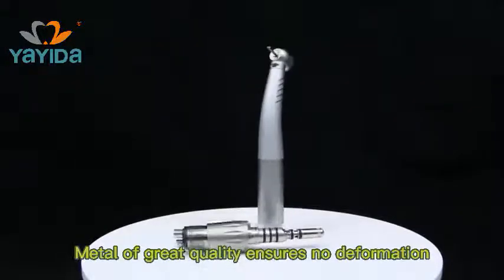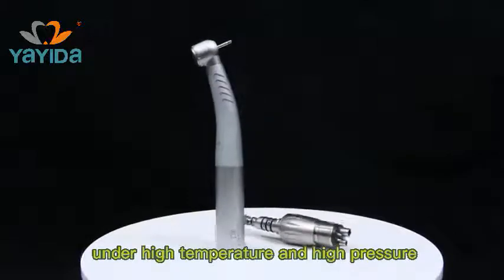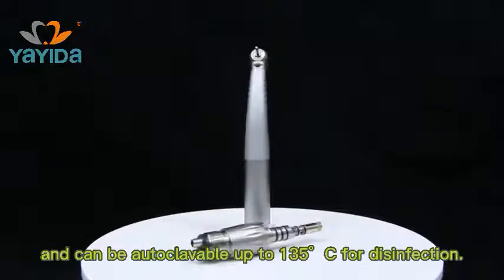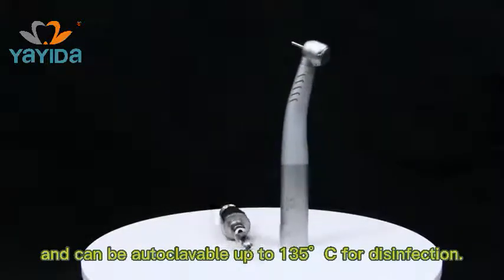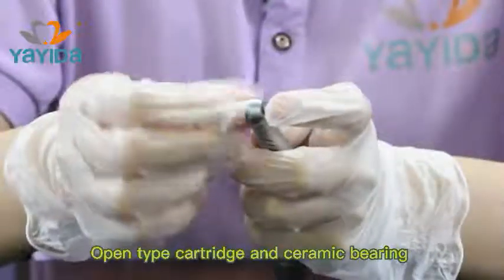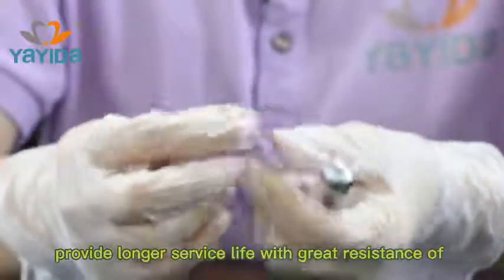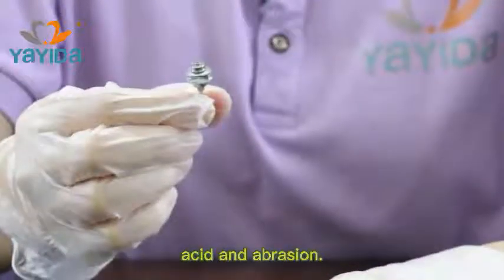Metal of great quality ensures no deformation under high temperature and high pressures, and can be autoclaveable up to 135 degrees for disinfection. Open-type cartridge and ceramic bearing provide longer service life with great resistance of acid and abrasion.